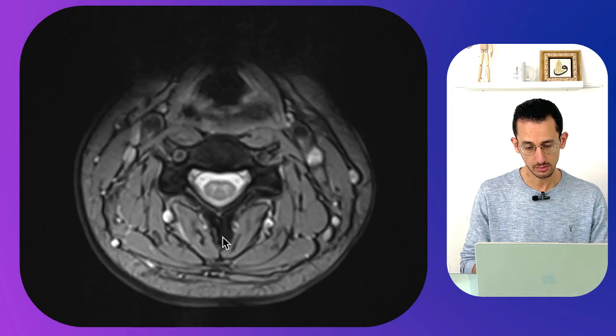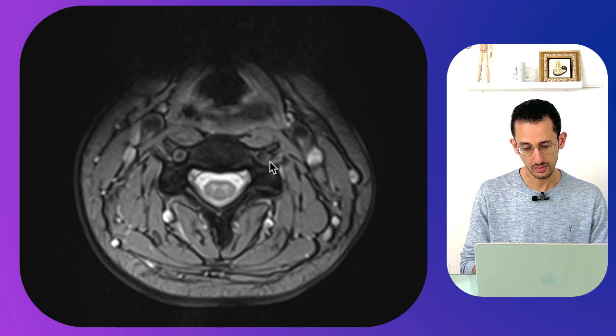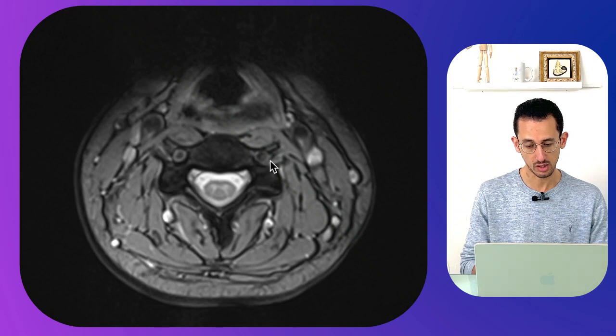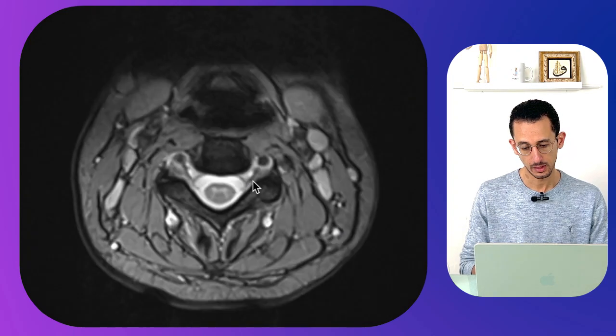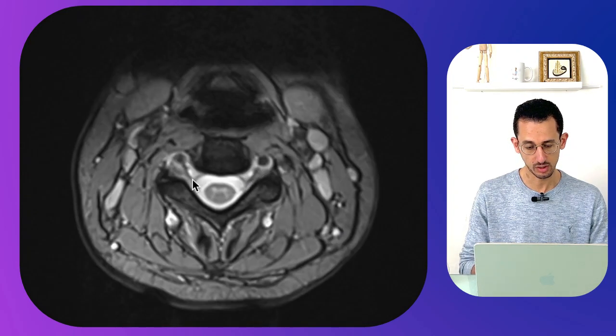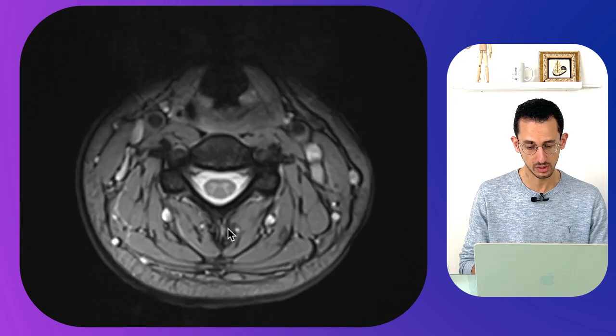Moving further out, there is a signal that looks like a flow void — that is the vertebral artery bilaterally. You need to correlate each axial section with the sagittal image, identify any gross abnormalities on the sagittal view, and see what's occurring in the axial view.